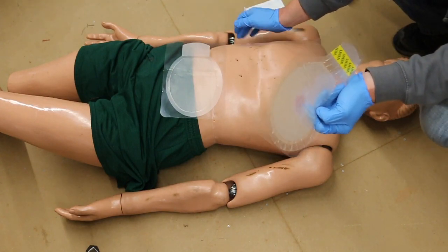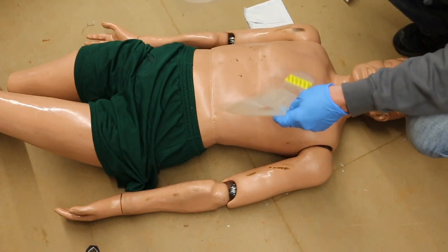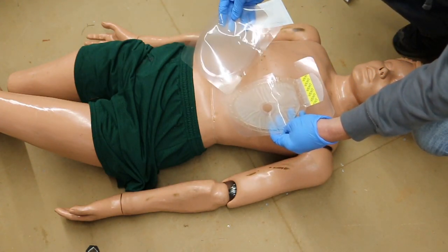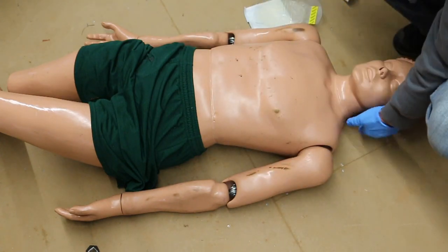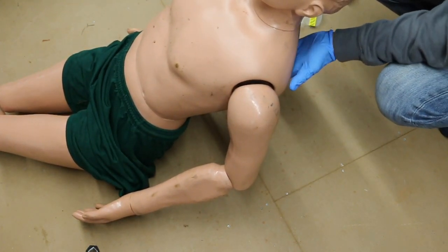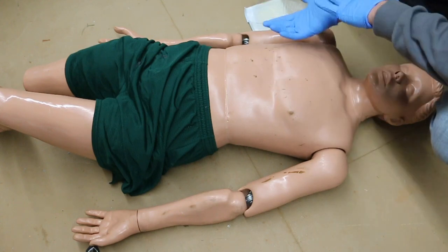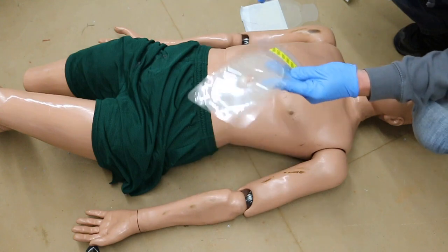If the back side has a hole in it, that's where I would use a non-vented chest seal, because if we have our patient laying on our back, then this chest seal on the back probably is not going to vent very well. So we can put the non-vented there. This is probably where it's going to vent. Even if we set our patient up and he's leaning against a stretcher, leaning against a tree, this back seal probably is not going to seal the best. So that's why we'll put our vented chest seal in the front, log roll him, and look for an exit wound or an entry wound, whatever.